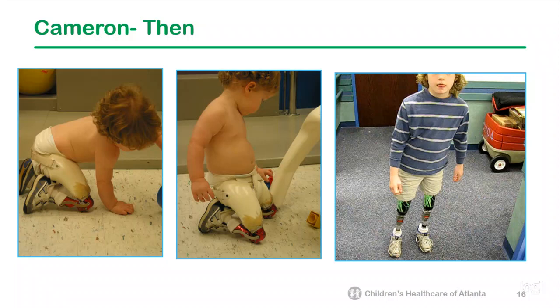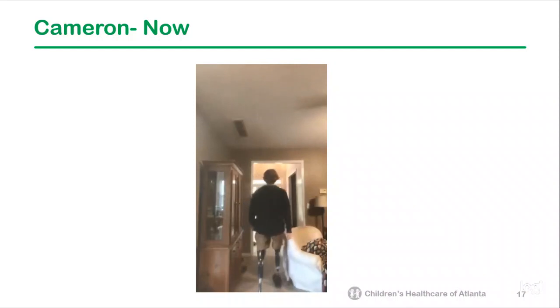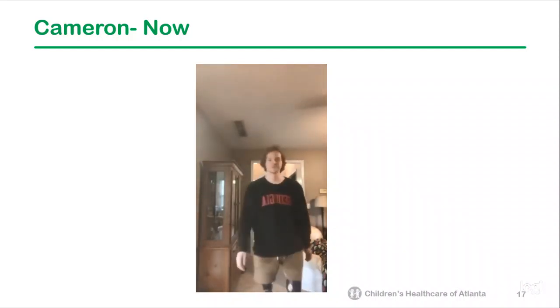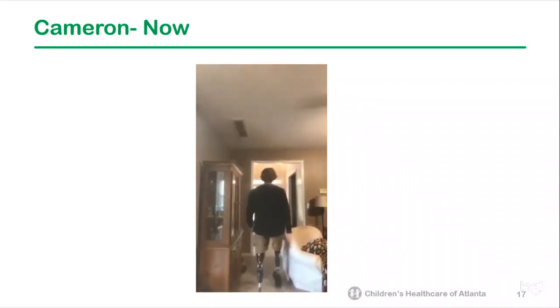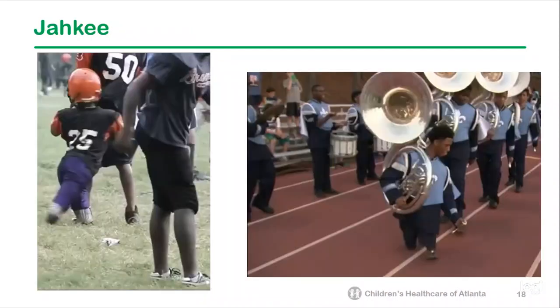He has been very active all along and routinely breaks components doing flips or horsing around with his friends. Cameron is now away at the University of Georgia, and his prostheses consist of suction sockets, Ossur Rheo XC microprocessor-controlled knees with dynamic feet. Here's a video of him walking. He uses these prostheses daily to get around campus.